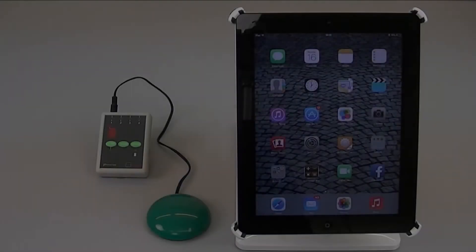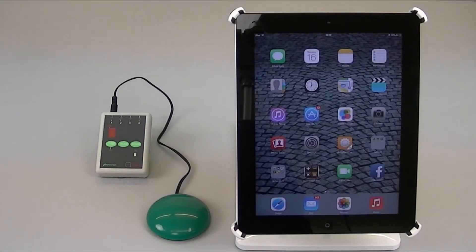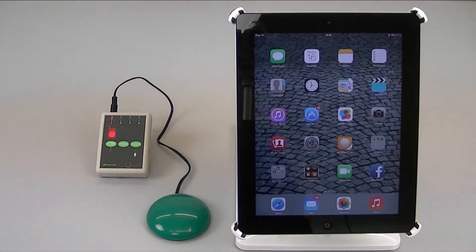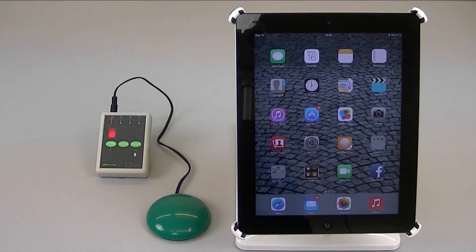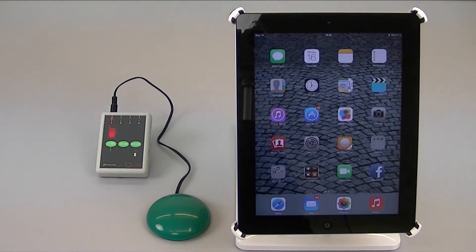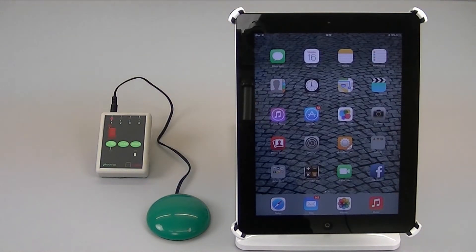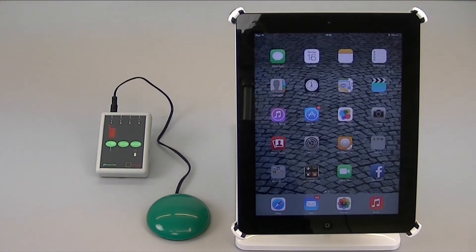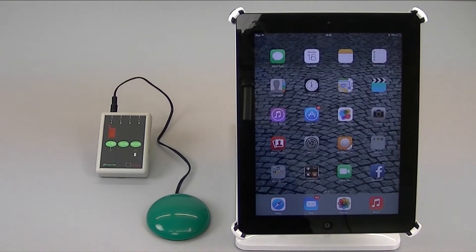Now I have the applicator set up with a single switch going into channel 1. Channel 1 is already configured for mode U which is the new combined enter home function. The idea of this is that if you press the switch for a short period you get enter, whereas if you press it for a longer period you get home.